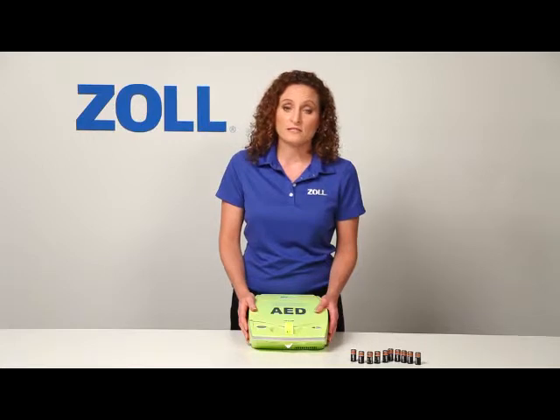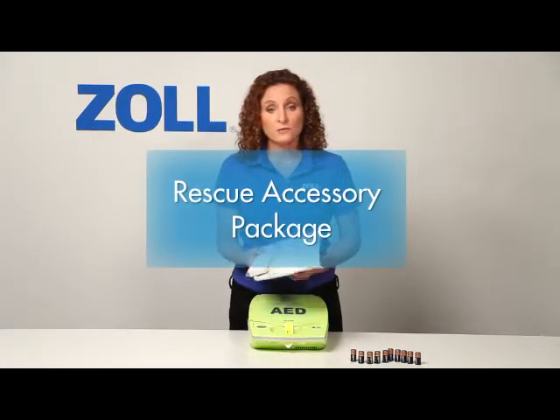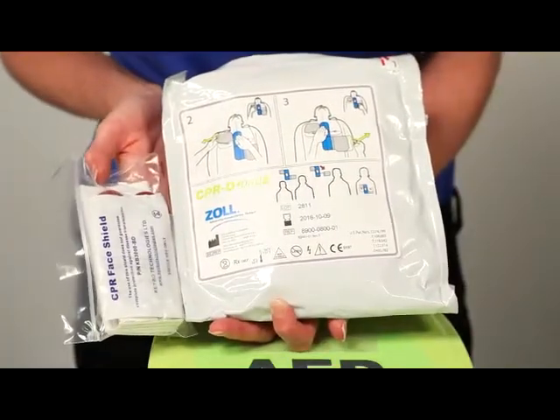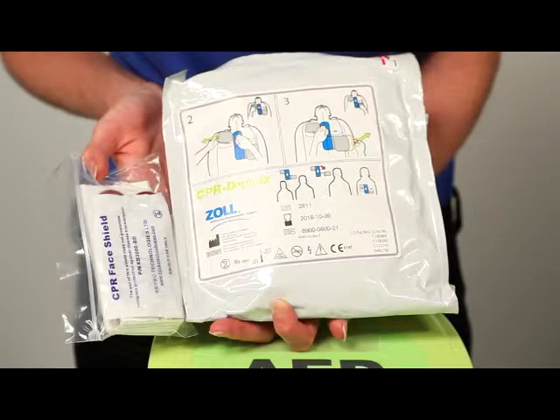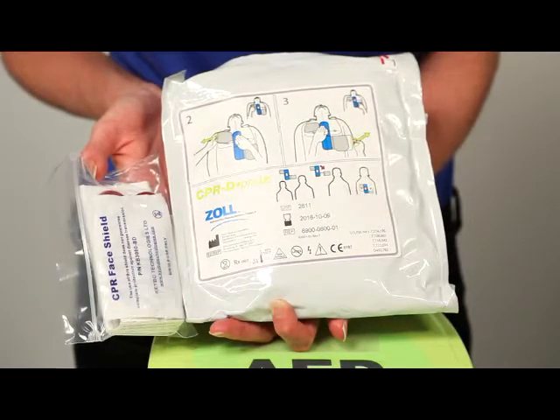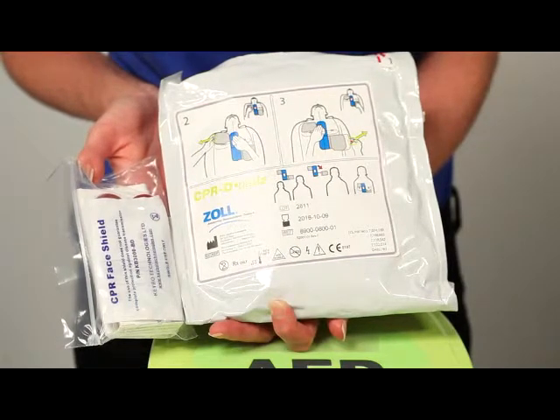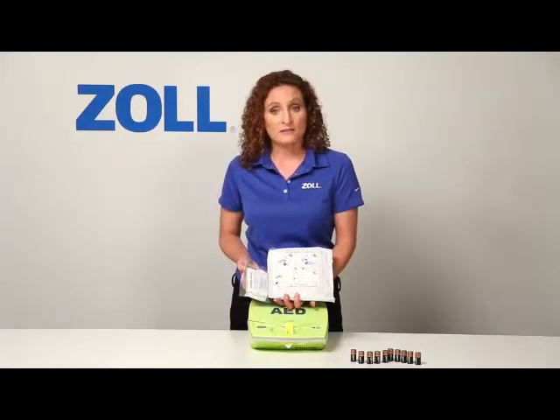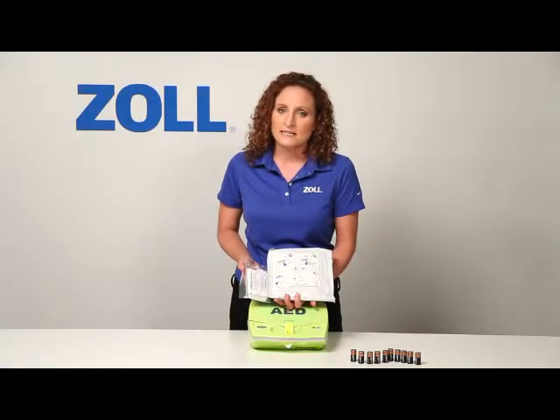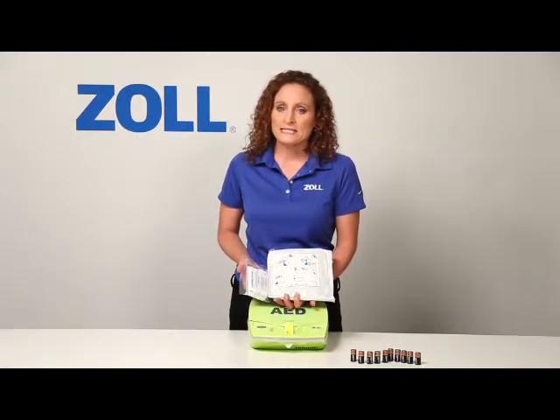Now let's move from batteries to pads. Every CPR-D pad has a rescue accessory package attached. It contains items you may need in a rescue, including scissors to cut clothes, a razor to remove hair, a paper towel to wipe off the chest if the victim is wet or sweating, a pair of protective gloves, a barrier mask for optional mouth-to-mouth breathing, and a wet towelette for cleaning up. No other AED includes this sort of support along with every set of pads.